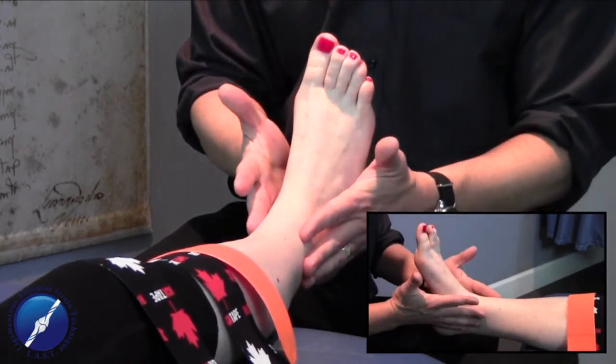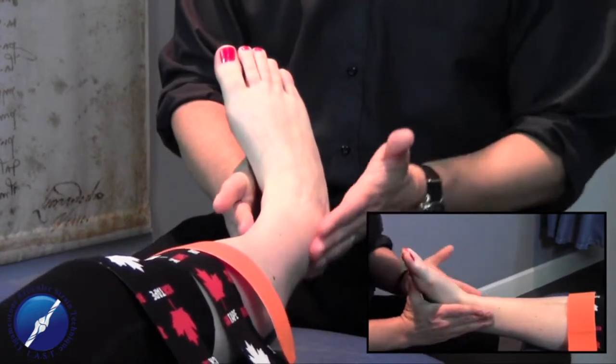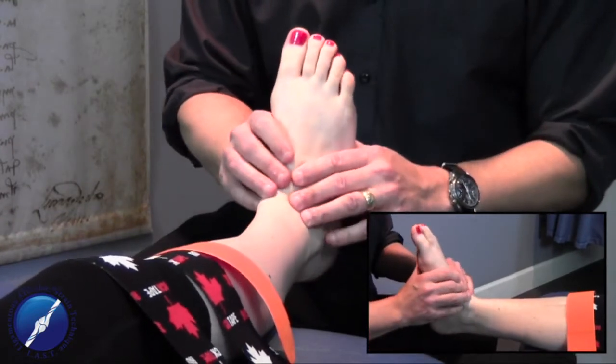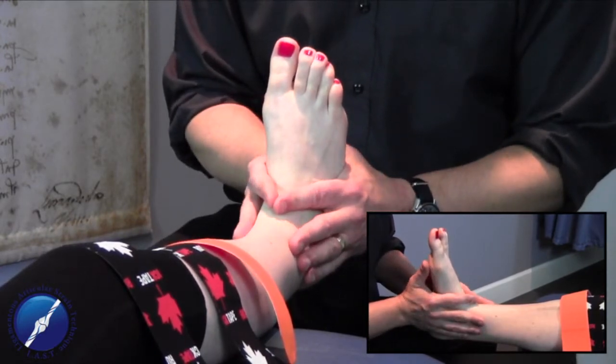This is mainly used for people that have had some type of an inversion sprain, where they've sprained their ankle this way. The lateral aspect is getting stretched and elongated. We're getting those danger threat messages happening through this area, so we really want to keep them in a neutral position when using the U-lock taping technique.